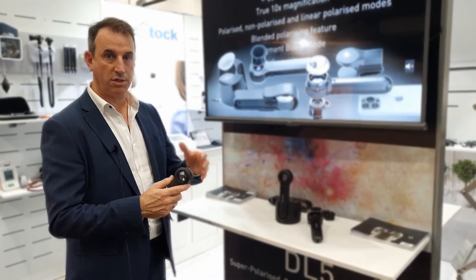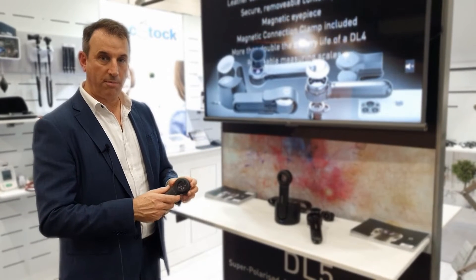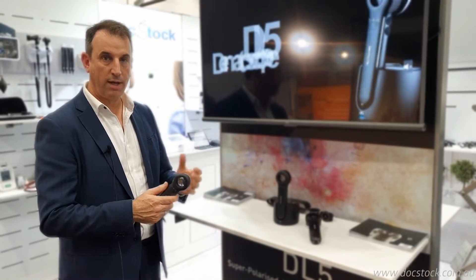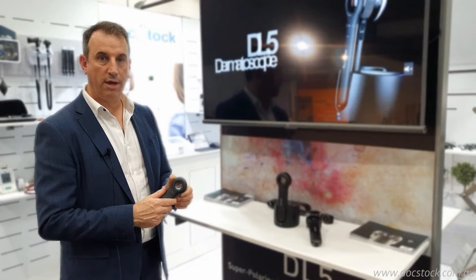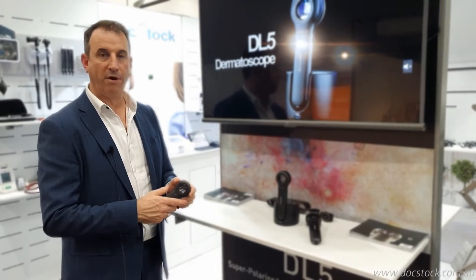It has linear polarizing in addition to the normal cross-polarized and non-polarized modes. We've got a UV mode, pigment boost, a torch mode, a ruler, additional charging and much longer power output from the battery. It also includes a leather case, a holster clip, and a phone adapter.